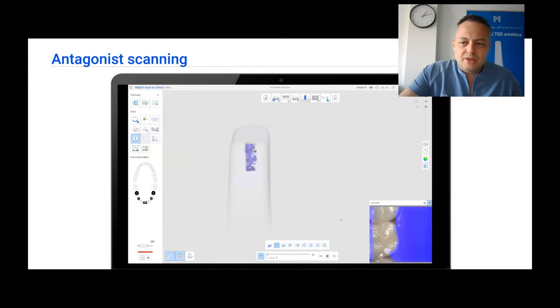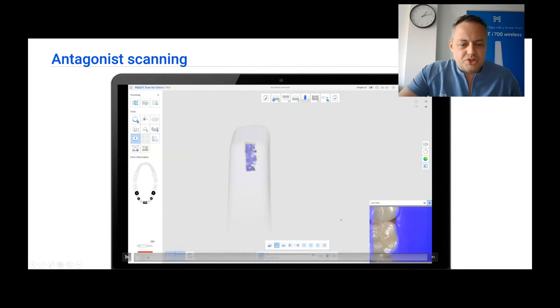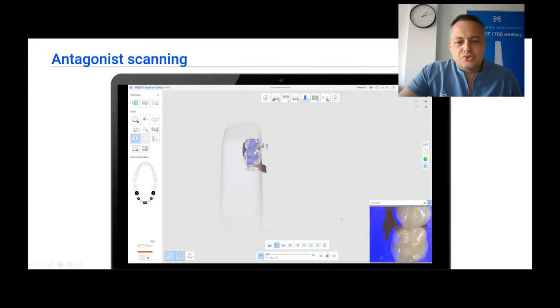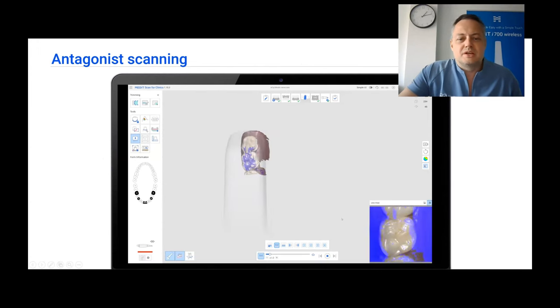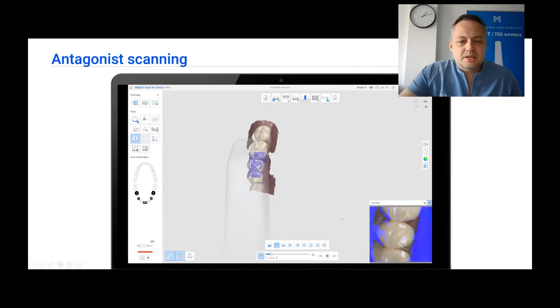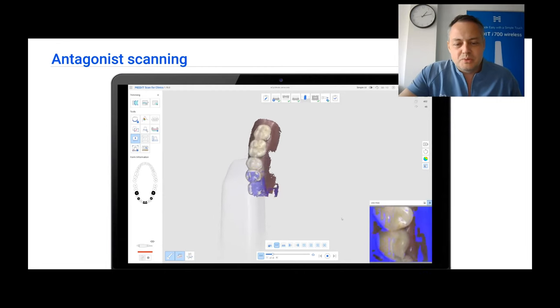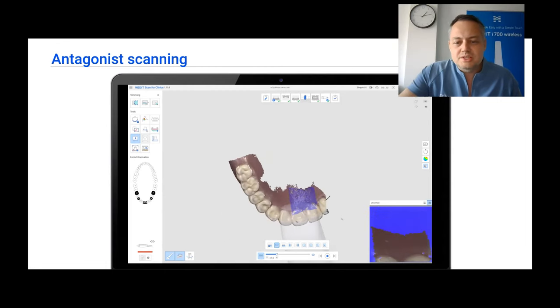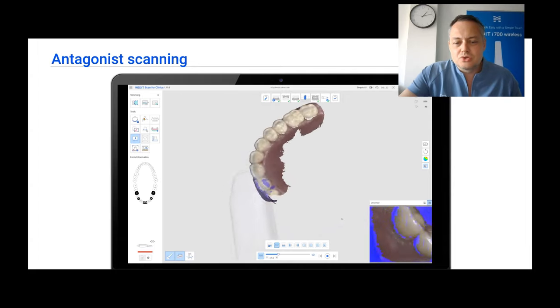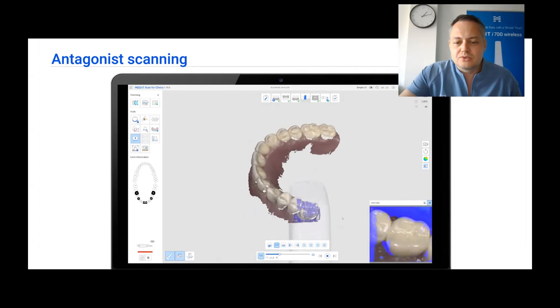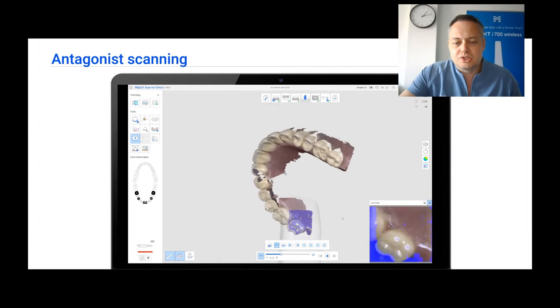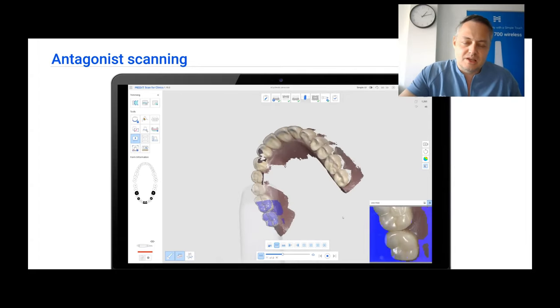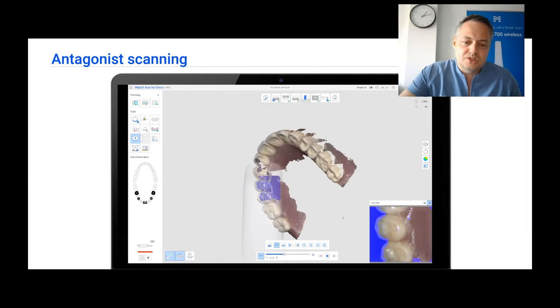To get all the needed information, we are going to need an antagonist scan, a pre-op scan, an op scan, occlusion scan, and also a lot of additional data scanning.